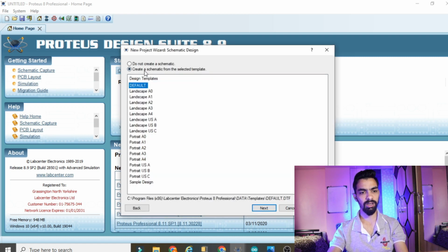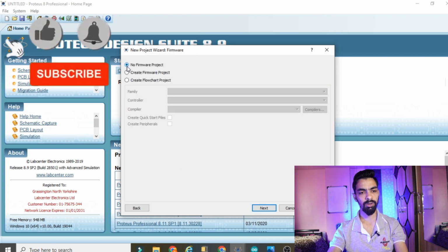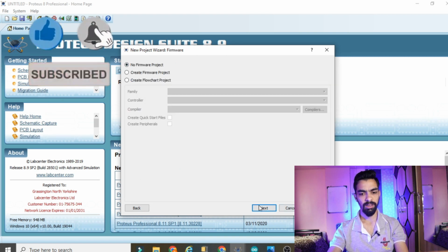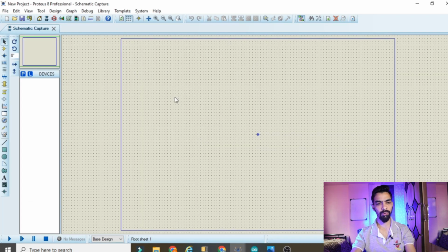Then select create schematic from the selected template. Click on the next button. Select do not create a PCB layout. Click on the next button. Here you select no firmware project. Then click on the next button and click on finish. Now you can see a blank window will open here.